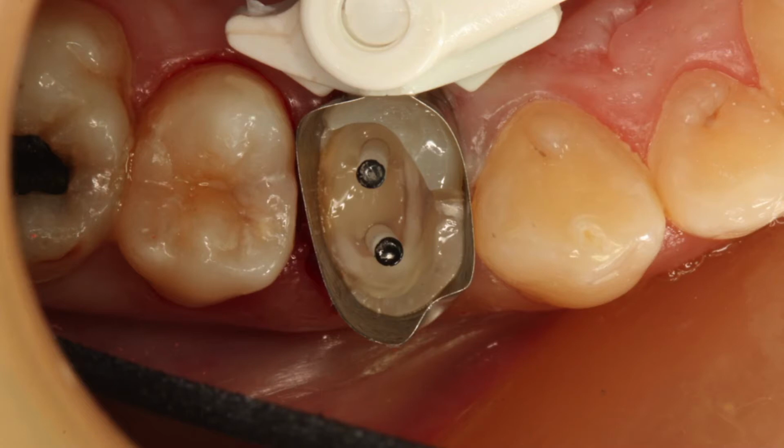But whose post system is that? I believe that is probably DMG's, because I think I photographed this for an educational series for them. But what I'm using here, Mike, the cool thing about this is, and you'll see this, I'm sure, in the lab too, a lot of dentists aren't putting posts in. Well, you guys may or may not know because you don't see the x-rays. But dentists don't put the posts in. Again, same reason they don't do the build-ups. They think it's going to take more time.